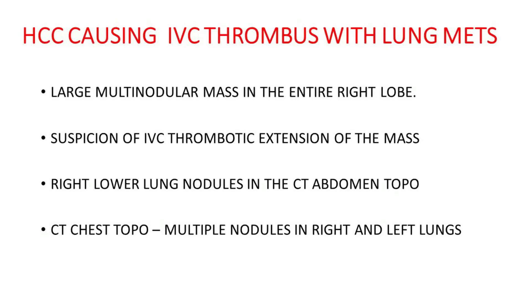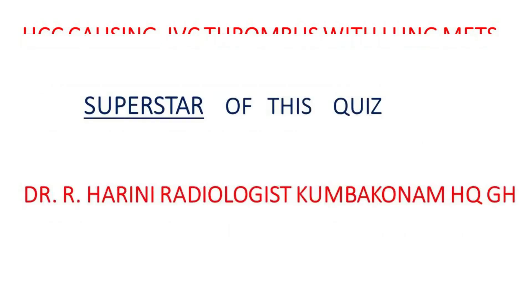Remember that a hypoechoic pattern in the IVC may be seen in most patients in the arterial and portal venous phases — especially the early portal venous phase. Do not judge these as thrombosis in the retrohepatic IVC. The retrohepatic IVC will show full enhancement in the late venous phase or equilibrium phase with no evidence to suggest any thrombosis.